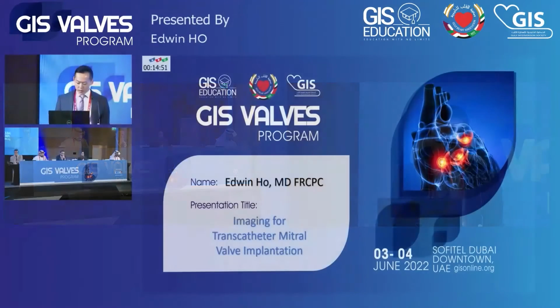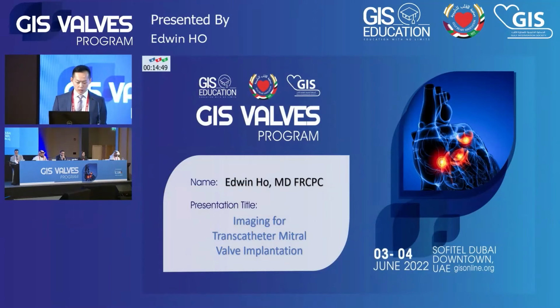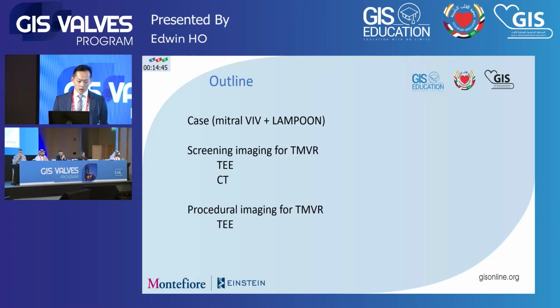So in the first 15 minutes, we'll talk a little bit about some of the imaging components of transcatheter mitral valve implantation. I always like to frame these sorts of talks around cases because it brings us back to our patients and what we're doing every day.